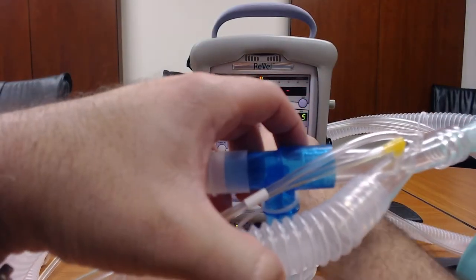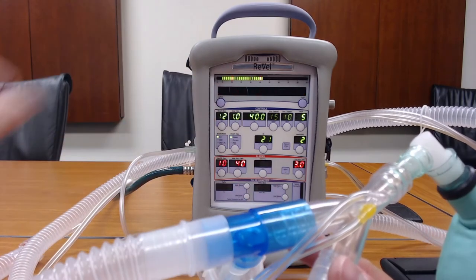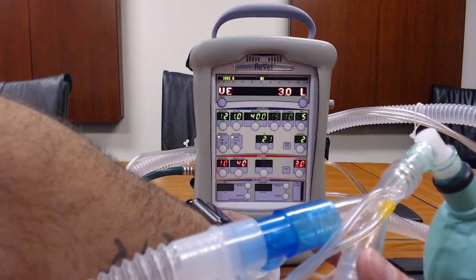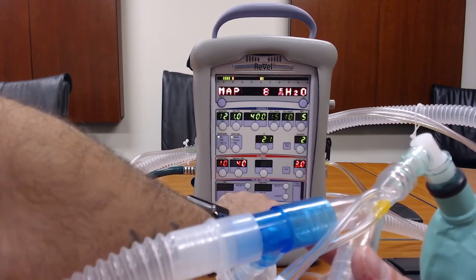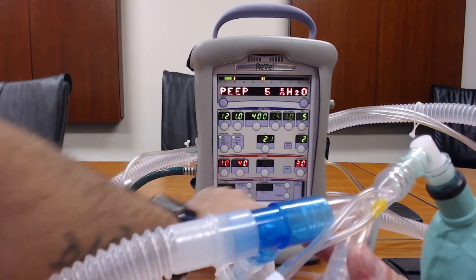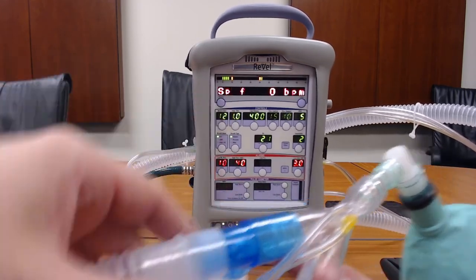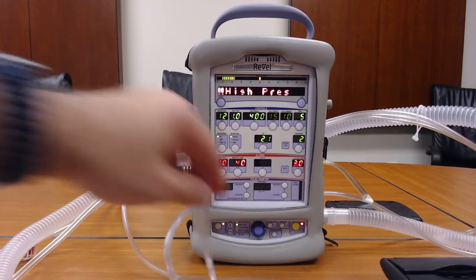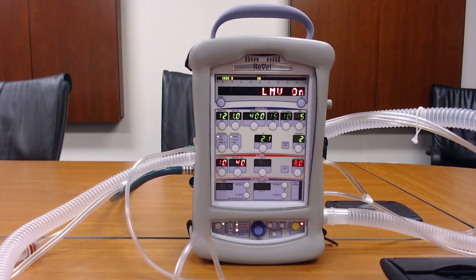As you can see in the display window, along with all the other parameters the vent gives you, you'll see a timer for the nebulizer so you know how much time is remaining. The nebulizer timer is running.